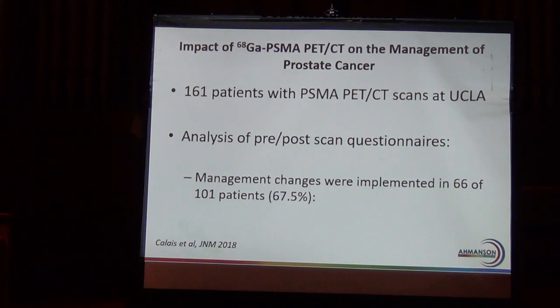This is just one of our earlier research studies where we looked at the impact of patients receiving this PSMA scan and how that changed the management of their prostate cancer. We enrolled 161 patients in this study. All of these patients received the PSMA PET-CT scan. And then we had pre- and post-scan questionnaires that were sent out to their urologists, asking them before the scan information was available how they would manage their patients. And then after the scan information was available, asking them again the same question, how would they manage their patients? And you can see that more than half of the patients' management changes occurred based on the information that was gleaned from the scans that these patients had.